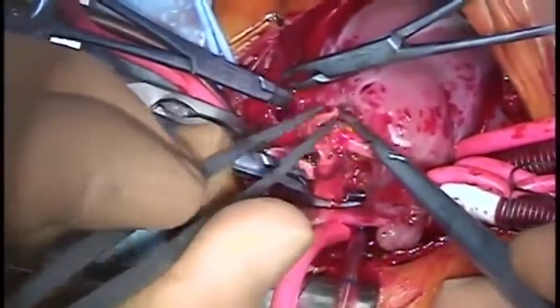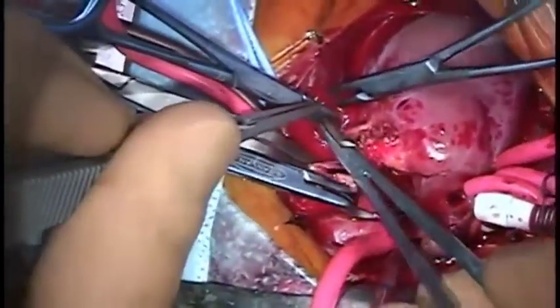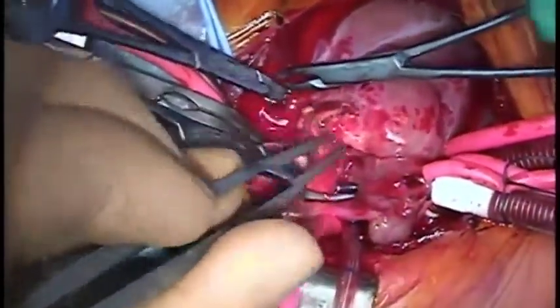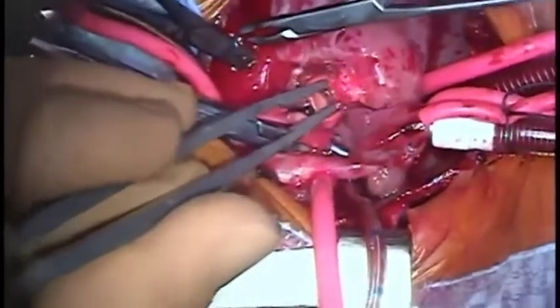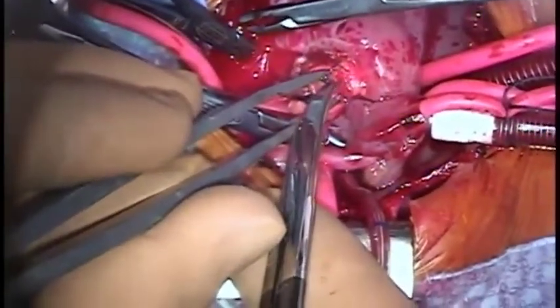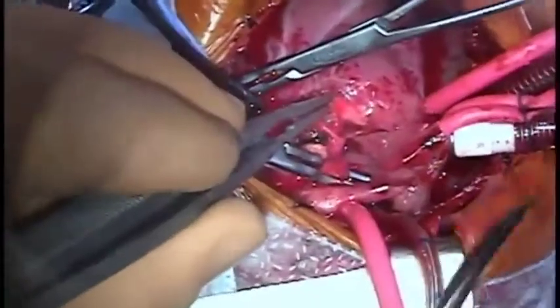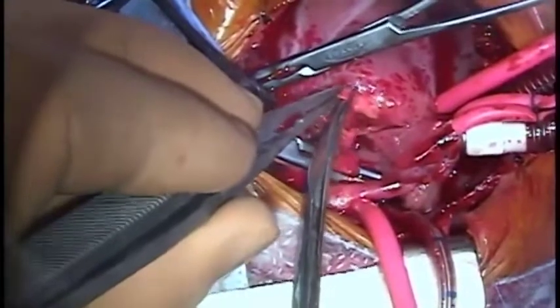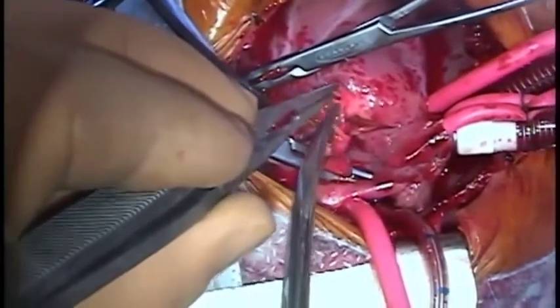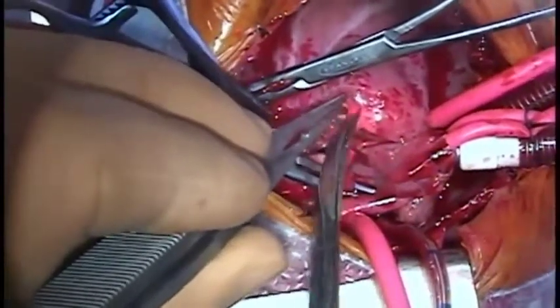Note the disproportion between the size of the neopulmonary artery and the branch pulmonary arteries. The disproportion is managed by means of a counter incision in the neopulmonary artery down to the level of the valve annulus. The position of the valve leaflets is constantly checked to ensure that they are not injured.